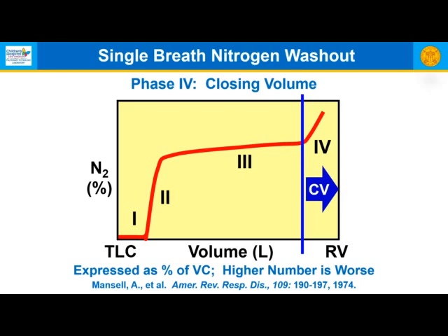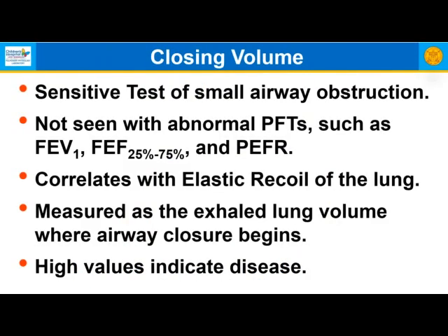So a higher value is bad because it means airways began to close earlier in exhalation. It is a sensitive test of small airway obstruction, but it's not seen with abnormal pulmonary function such as FEV1, FEF 25-75, or peak flow.